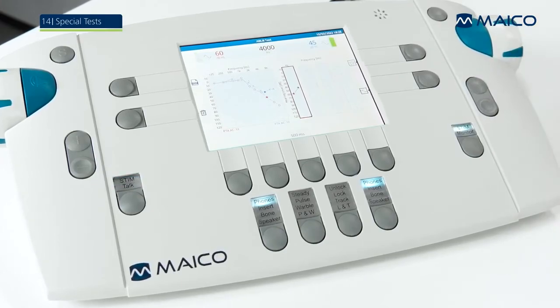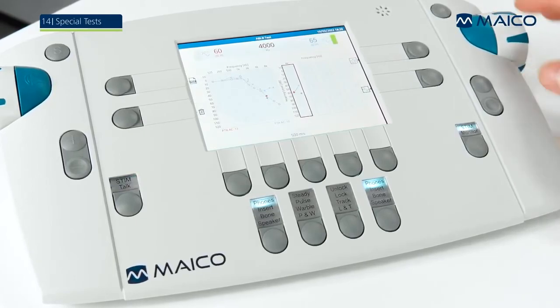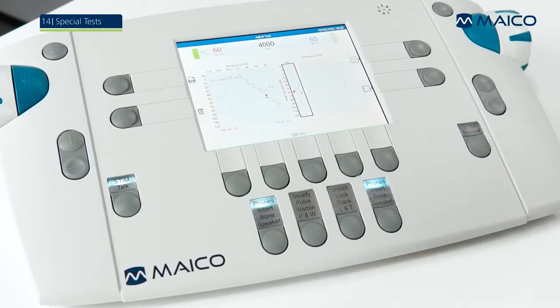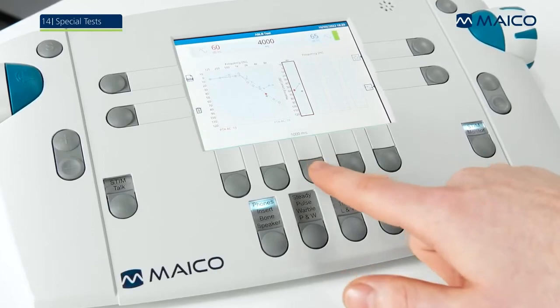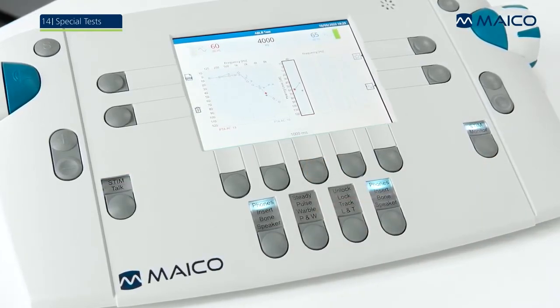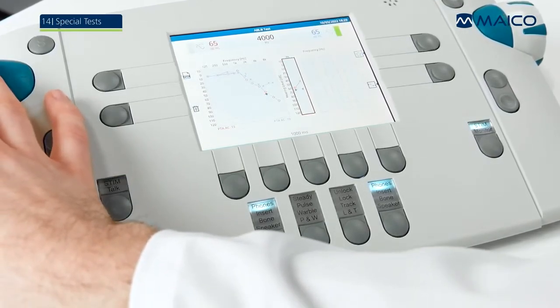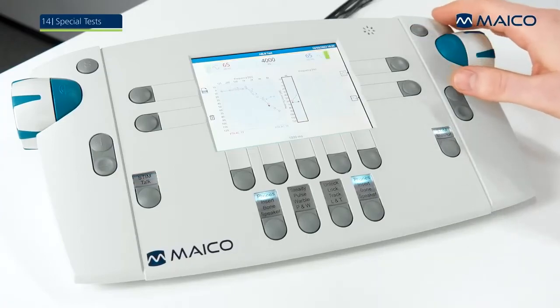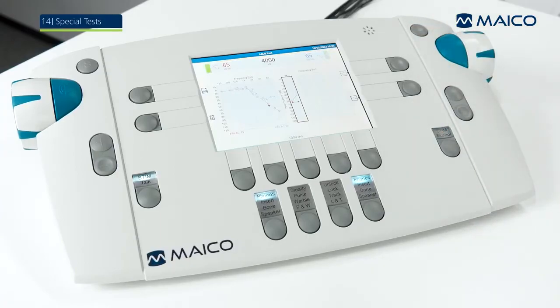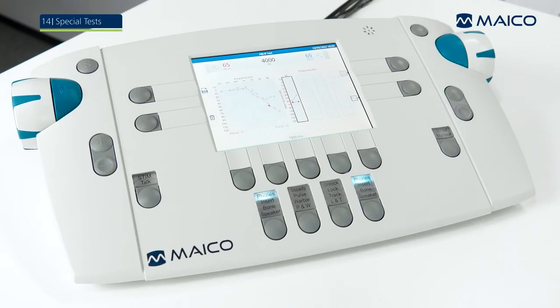The duration of the presentation can be selected between 500 and 1000 milliseconds. Then increase the level in 5 dB steps until the patient indicates that the loudness is perceived equally in both ears. Use Store to save the measurement points and repeat the measurement until complete loudness balance is achieved. To stop the test, end the tone presentation as usual with the stim button.